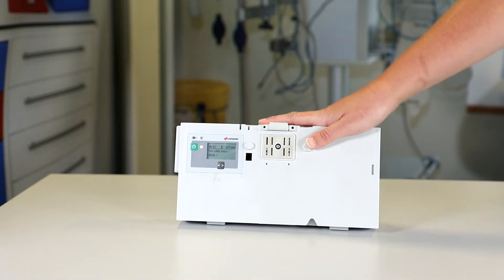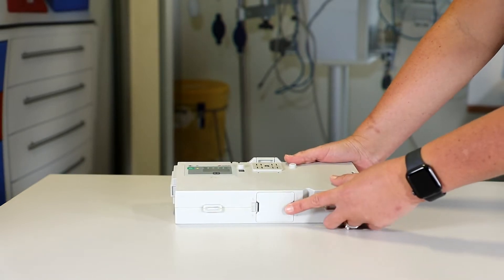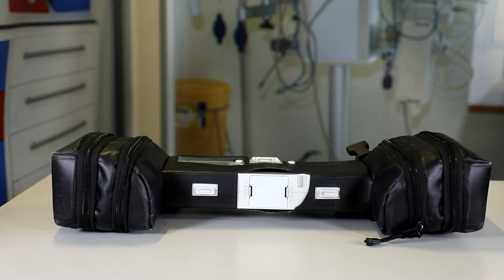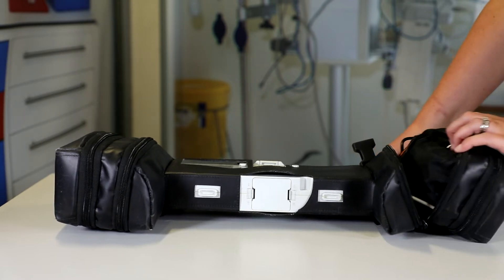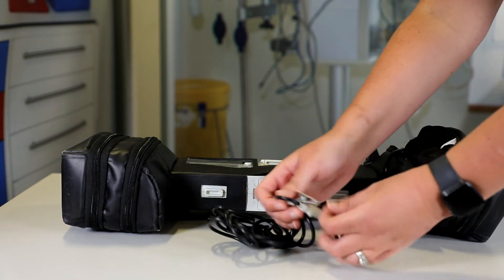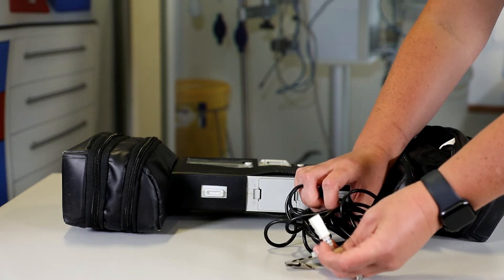Again we remove and examine the battery compartment — the battery on this is located just here and we would only do this pre-flight. Once you've done all the physical checks on the patient box, the next thing is to inspect and examine all the cables and consumables, looking again for any dirt and damage. You would take them out individually — for the purpose of this video I'll show just one, but we would get all the leads out to make sure we're happy with them, looking for any cracks, dirt, or damage prior to the mission.